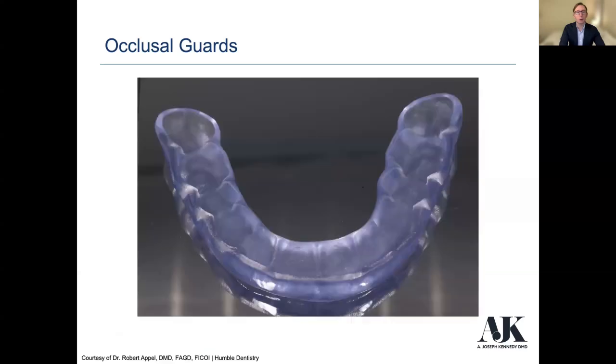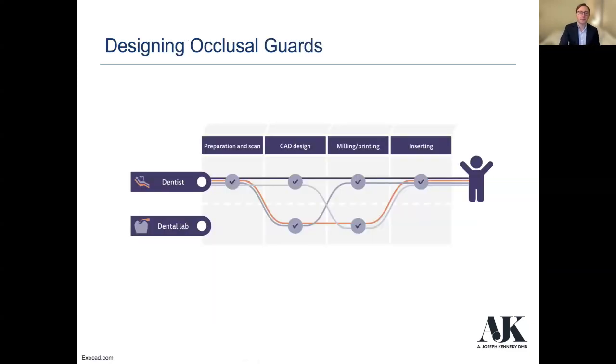Occlusal guards. So here's a picture of one that, again, my colleague and close friend, Dr. Rob Appel, down in Texas, sent my way. And you can see it's a resin-based occlusal guard. He printed it on his printer. Looks pretty standard and fit the patient beautifully. So how do we design things?